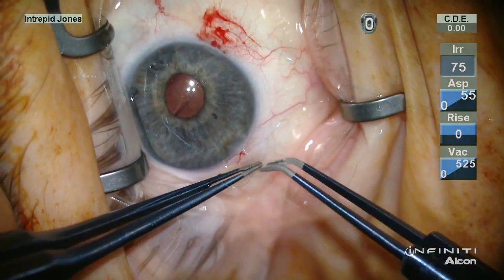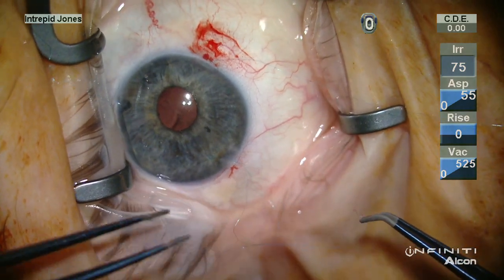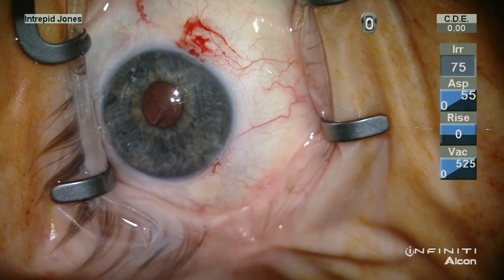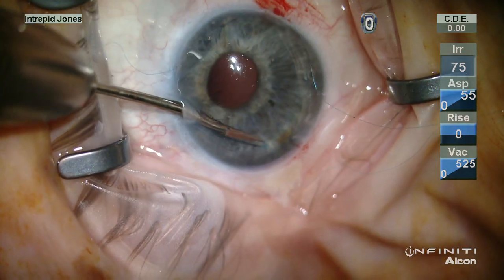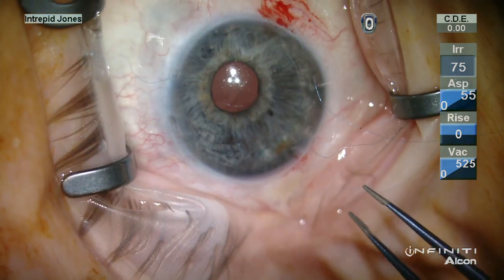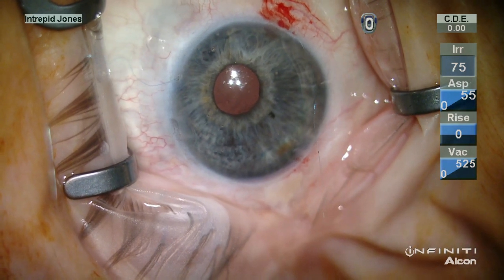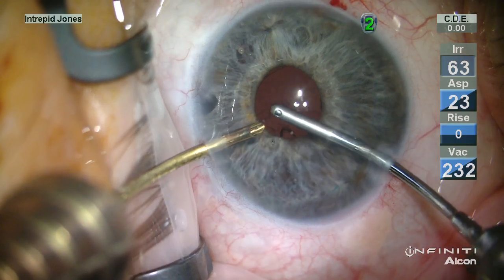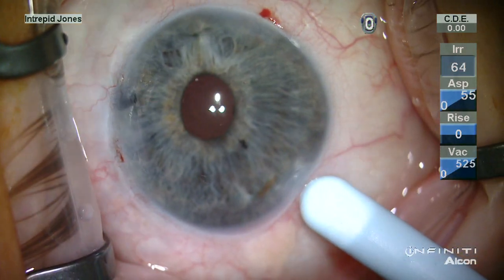The sutures are then tensioned and locked and additional throws, usually of a single knot variety, are added for security. Micro scissors are very useful for trimming the knot inside the anterior chamber, and bimanual IA is used to evacuate viscoelastic. This patient ended up 20/15 uncorrected.